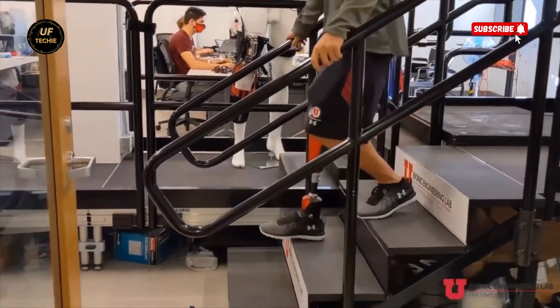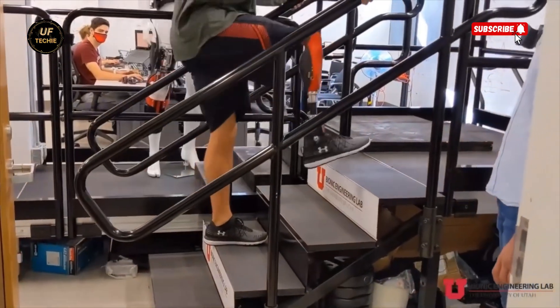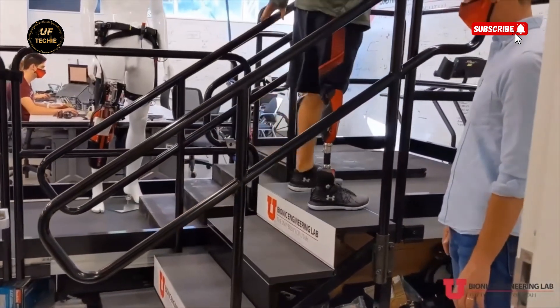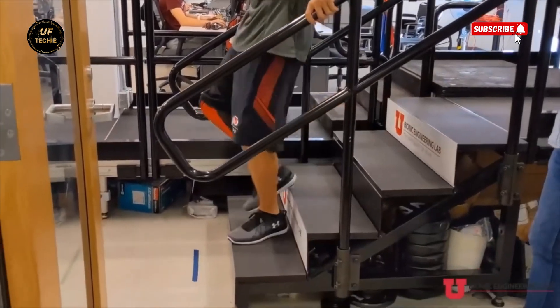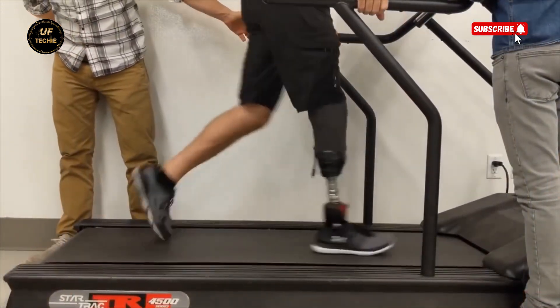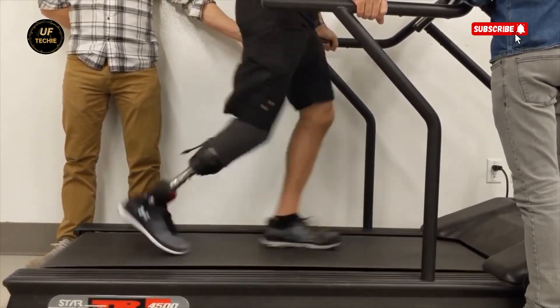Bionic M's innovation has already caught the world's attention. From over 4,000 international design entries, their robotic legs stood out as truly exceptional, earning the prestigious Red Dot Award Luminary in 2020 — the highest honor in one of the world's most respected design competitions.